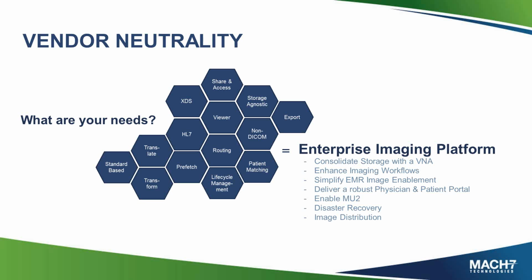And some of them as well will claim that from a non-DICOM perspective that they support it through XDS. I would say one caution there is if dermatology doesn't support DICOM, they probably don't support XDS either. So looking at your enterprise and forming that strategy, I would also take into a lot of consideration around non-DICOM and how that vendor-neutral archive really supports it, because this is where some of the points of differentiation start to vary. Building upon that too is XDS.